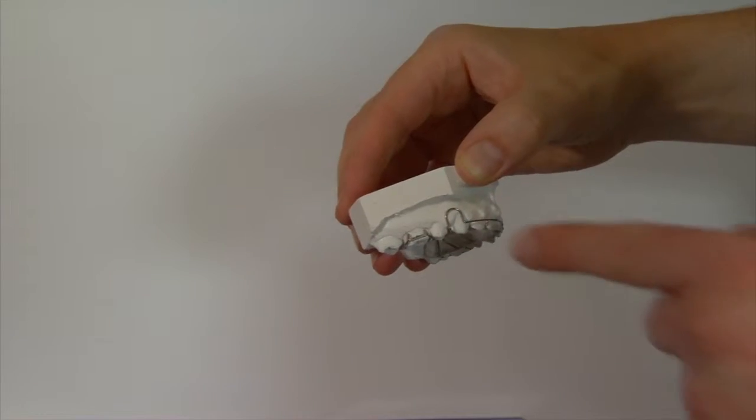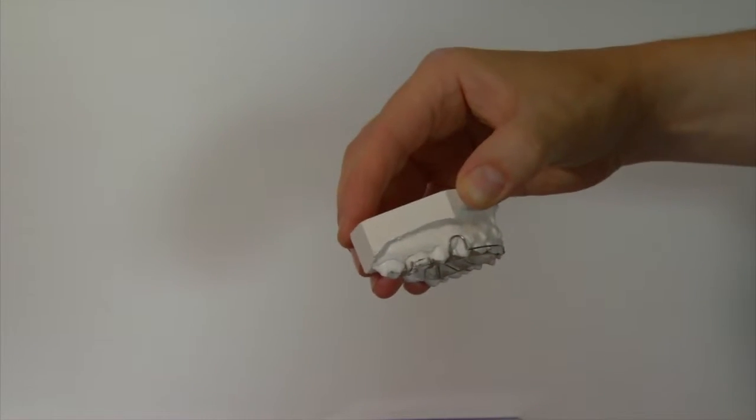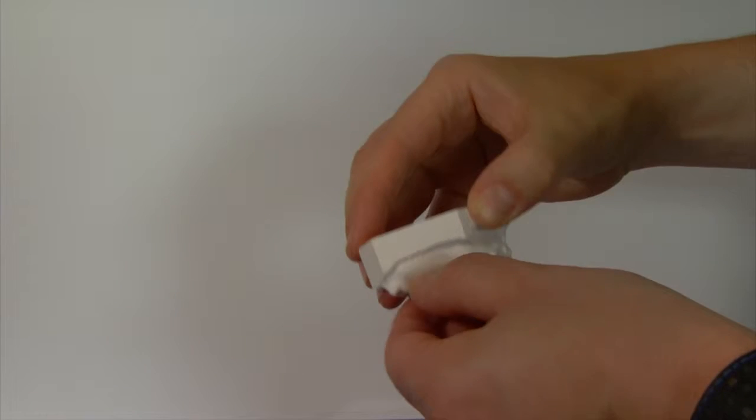Remove it by pulling gently on the clips around your back teeth. Don't try to remove the brace from the front, as the brace is weaker here and more likely to get damaged.